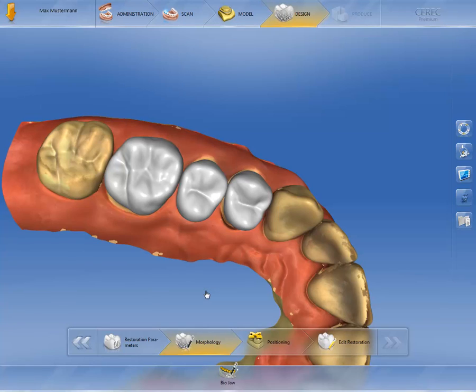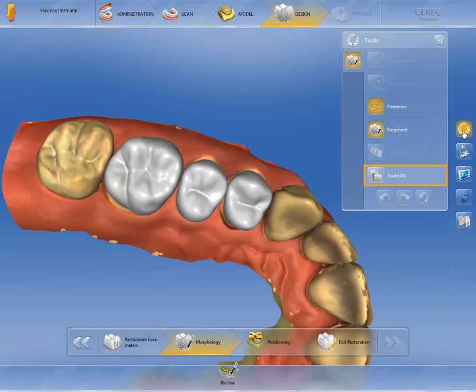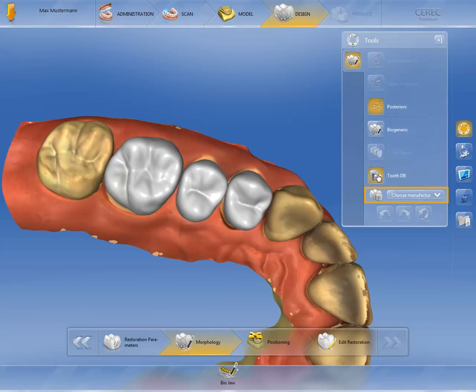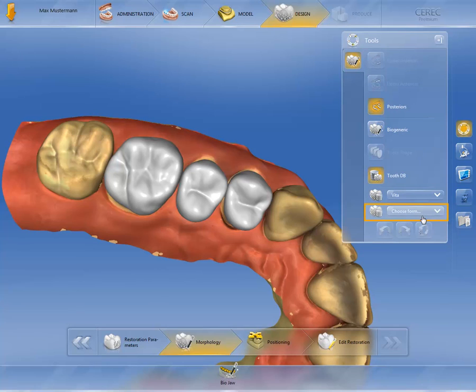CEREC Premium always first proposes a restoration calculated by biogenerics. You can, however, also use one of the proposals from the tooth database. First, select the manufacturer, followed by the desired form.